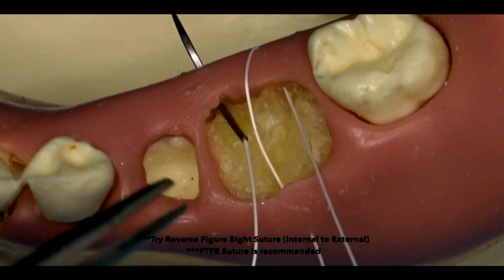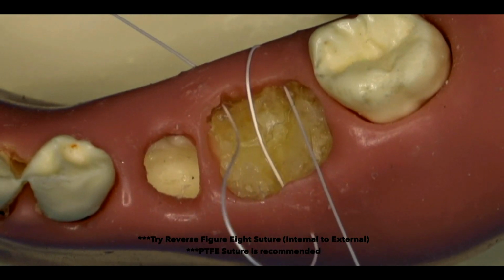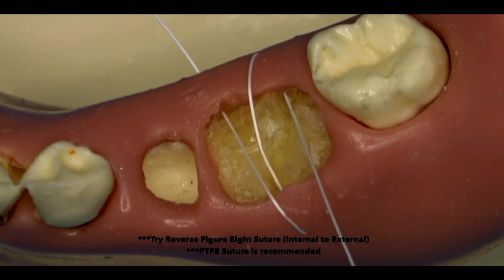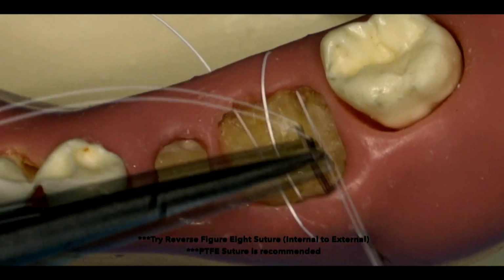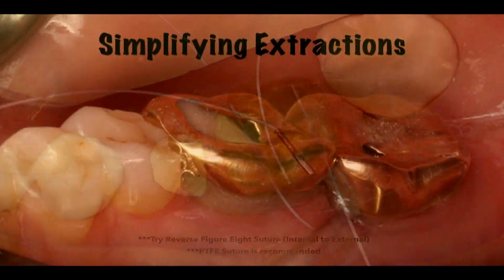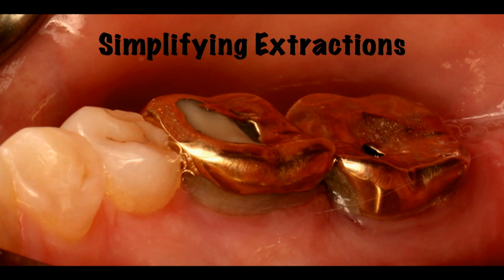And what you end up having when you're tying the suture off is you get the margins of the tissue, the marginal tissue, to almost invert a little bit, and that helps to keep the bone graft and that membrane in place as well. So that works very well for us for these small sockets. And again, this is a very simple case. We're going to move to some more challenging ones, but the key to these types of cases, as John's going to show you, is atraumatic extractions.